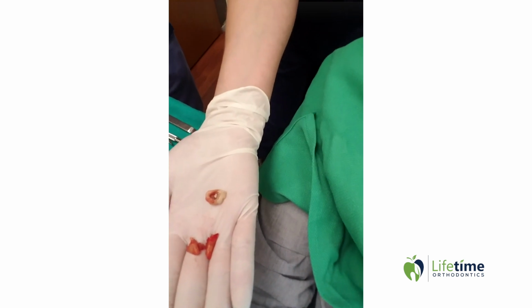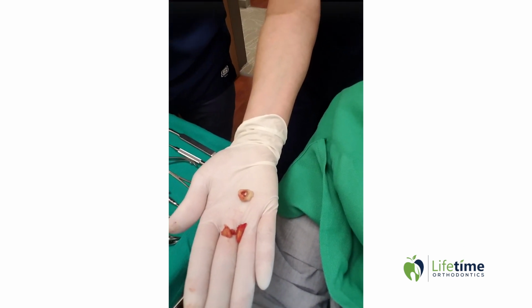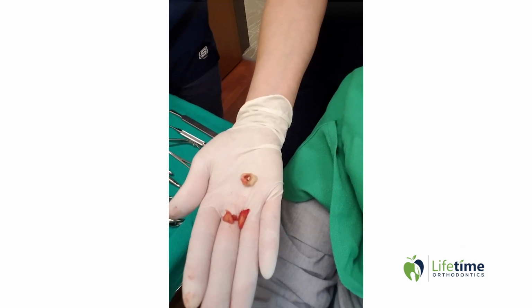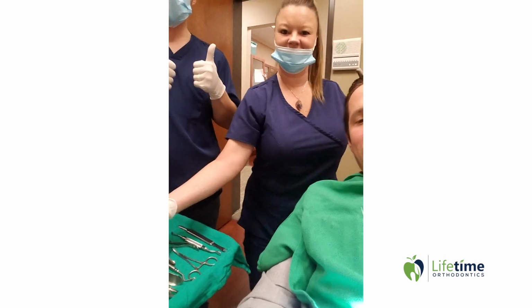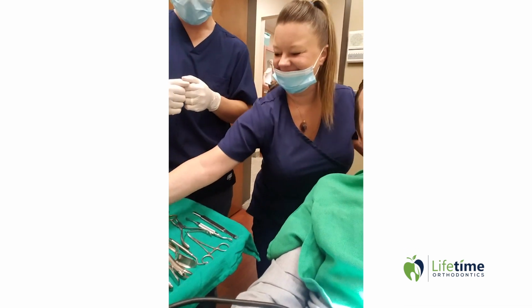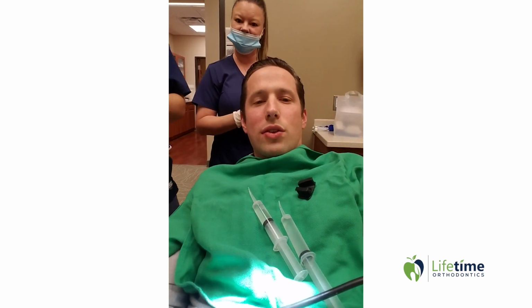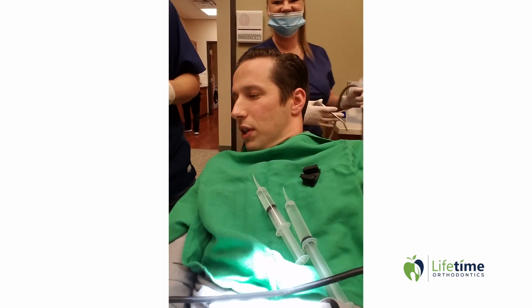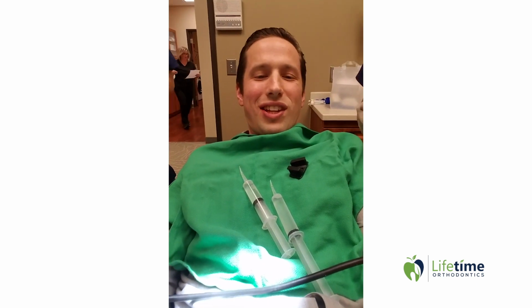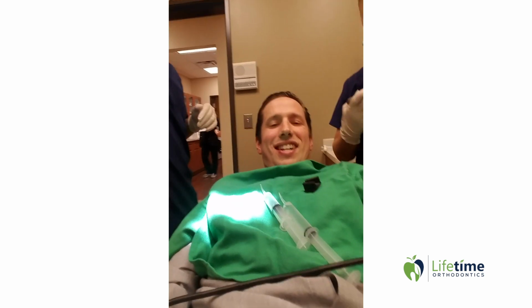Because that tooth had that cavitation, it was brittle, it was just too fragile, and just the way everything was looking, it was too hard to take that out in one piece. So it's just easier to section those sometimes, and that's where we're at. Now he's going to put a little graft in there so we can preserve the bone, so I have as much bone there as possible once we're ready to receive the implant, once I'm finished moving teeth. So I'm going to shut up here and let them continue their work because I'm sure they got more stuff to do today. All right, we'll carry on from there.